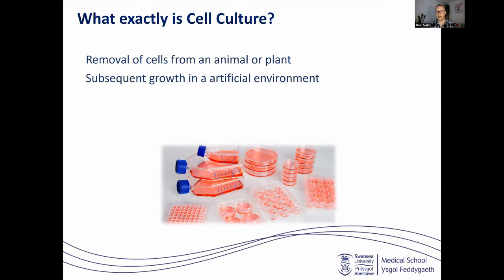Now, this is the type of setup that you will likely have seen if you're watching BBC News at 6 o'clock and they're talking about the new medical breakthrough. All of these pretty colours, all these pretty plastics, but this is cell culture. So, in these flasks, on these plates, there are cells growing on them, and that red liquid, which looks a bit like Lucozade, is growth media filled with sugars and salt and amino acids to allow the cells to grow.